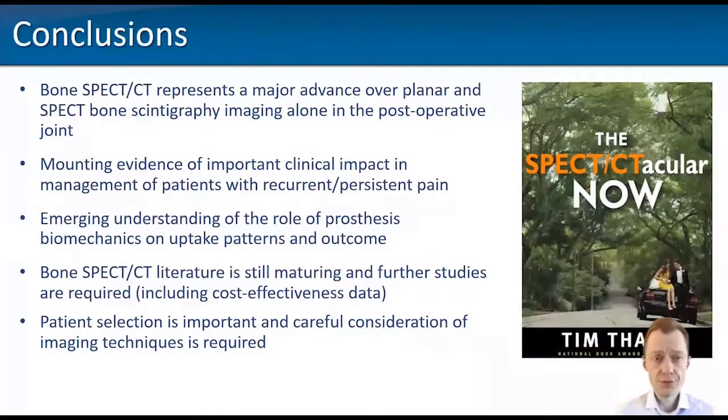So in this very brief overview of bone SPECT CT in the post-operative joint, I hope I have been able to convince you that SPECT CT is a major advance over planar and SPECT imaging alone in the post-operative joint, and that mounting evidence of important clinical impact in the management of patients with recurrent and persisting pain after joint procedures is available. It is also linked to an emerging understanding of the role of prosthesis biomechanics on uptake patterns and outcome. Of course, I do recognize that the literature is still maturing and further studies are required.